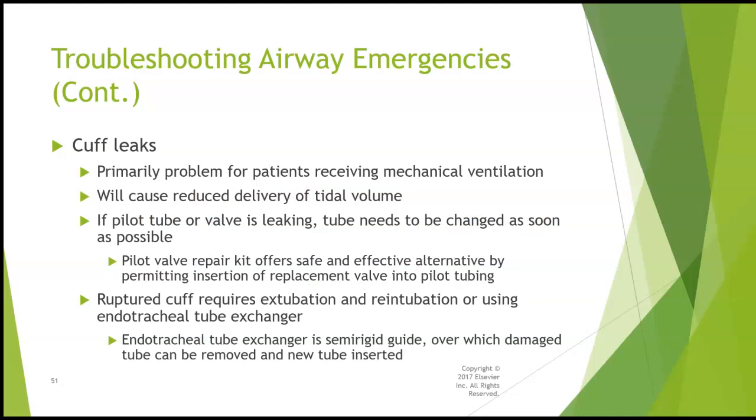Cuff leaks can happen from a leak in the cuff, in the pilot tubing, or in the valve that's on the pilot balloon. All of those can cause some sort of an airway leak. And this can be a real issue with patients who are receiving mechanical ventilation because that cuff needs to be sealing the airway in order for positive pressure ventilation to be effective.